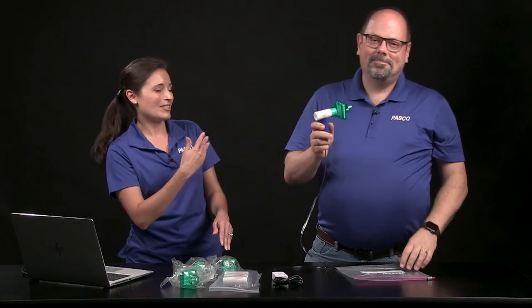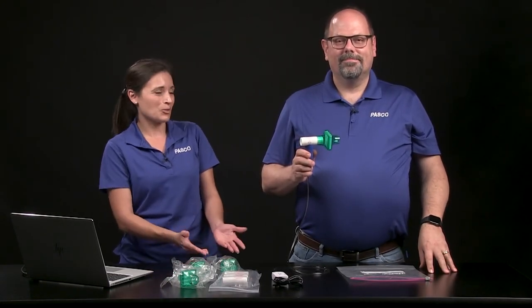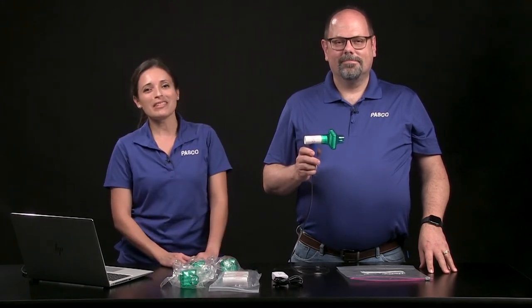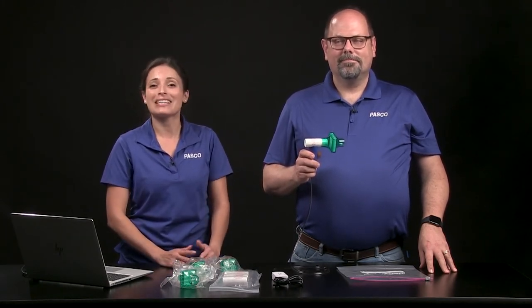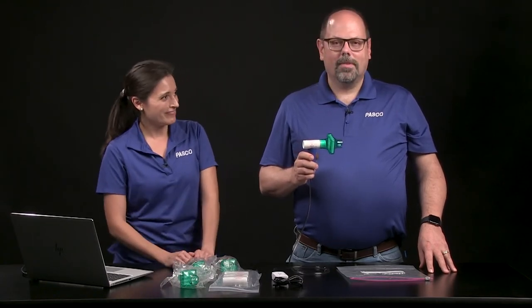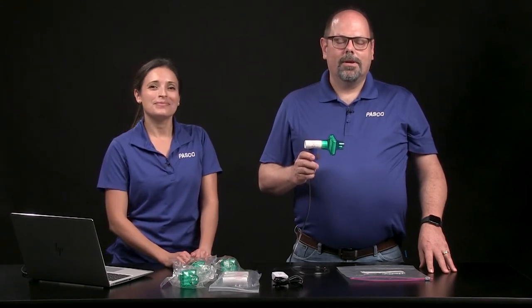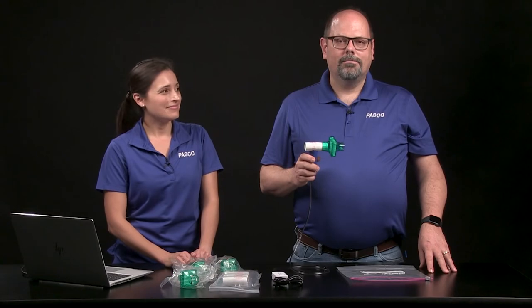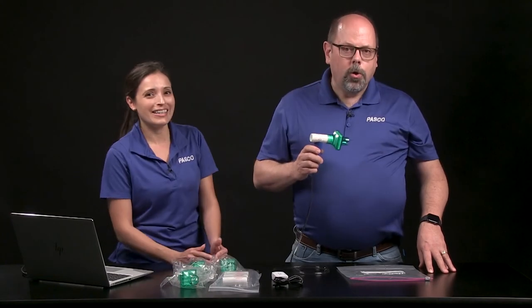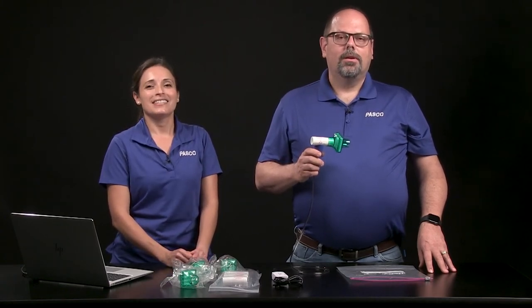Now we can practice the breath cycles — but during the real test, the filter stays in your mouth the whole time. Here's how the breathing will go: each breath is an inhalation followed by an exhalation. Take four normal breaths — one, two, three, four — then maximum inhale followed by forceful exhale, and now two normal breaths — one, two.